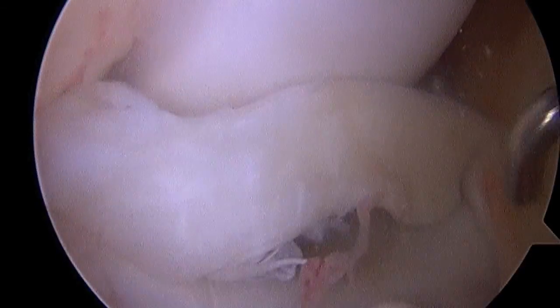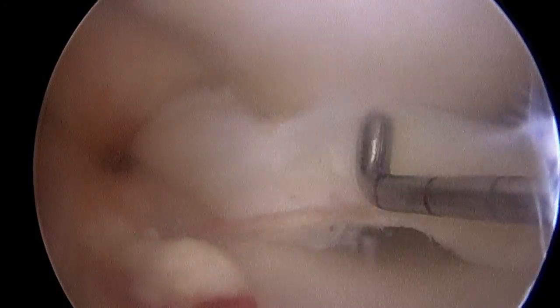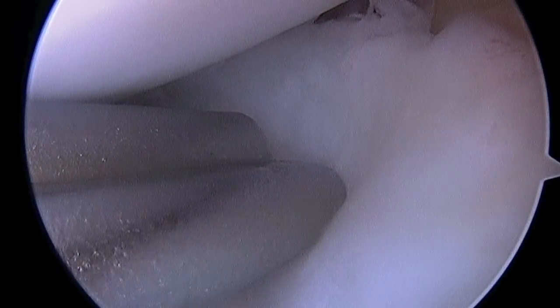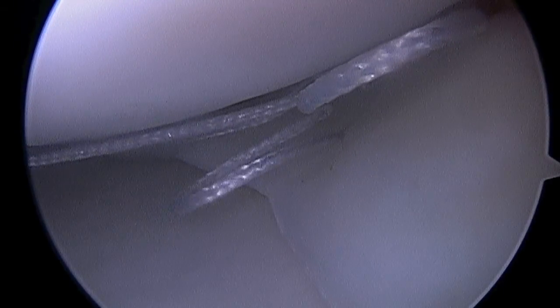Here we have a video of a bucket handle meniscus tear. You see the meniscus entrapped around the medial femoral condyle — I'll trace out the meniscus and the anterior horn there. First, I have to reduce the meniscus back into place — there you see me pushing with a probe — and now it's back in position on the other side of the femoral condyle where it should be. We'll then do an inside-out repair: passing a needle through the meniscus and out another incision on the back of the knee to an assistant. One stitch is already in place; now I'm passing my second pass. As the assistant pulls the slack out, you'll see the stitch pull the meniscus down into position against the posterior capsule, and when I tie that down, we have a very strong repair.